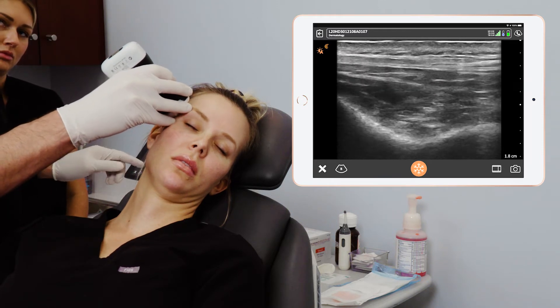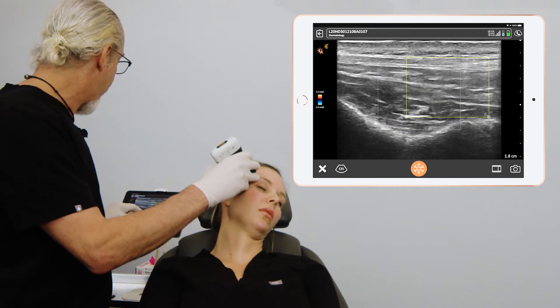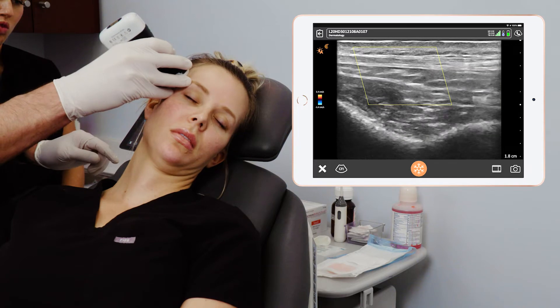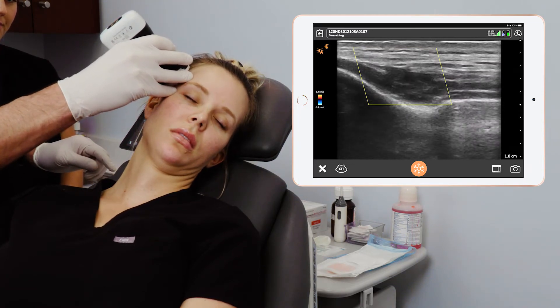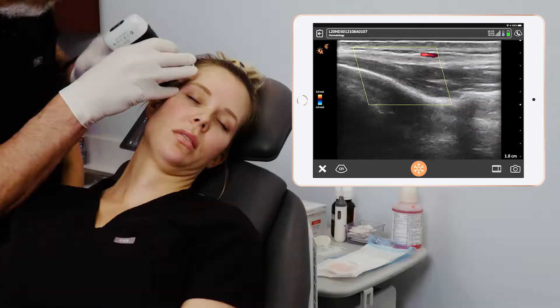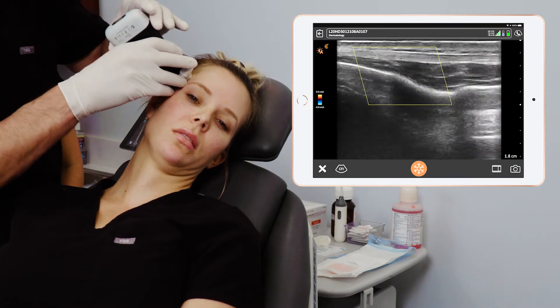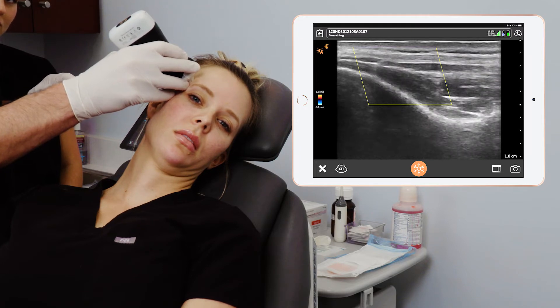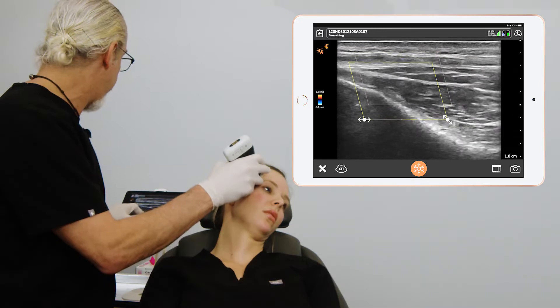Let's change over to color Doppler mode and look for the vasculature. I always do a color box steering for that. Back here is our superficial temporal artery — right there. It's pretty posterior to where we want to be. We're going to be injecting inferior to that and deep to that. Let's look and see if there's any other vasculature — I'm going to look for the deep temporal artery.